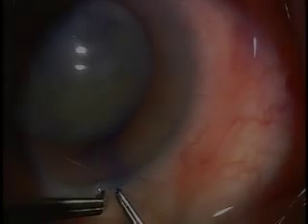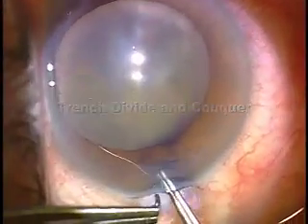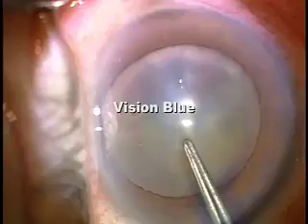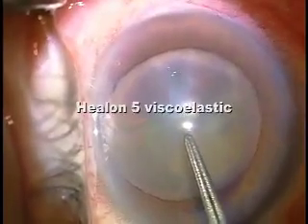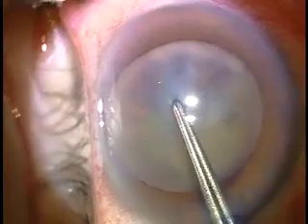I'm Dr. Gimbel demonstrating Trench Divide and Conquer. I'm using Vision Blue to demonstrate the capsulorrhexis. Healon 5 is my preferred viscoelastic.